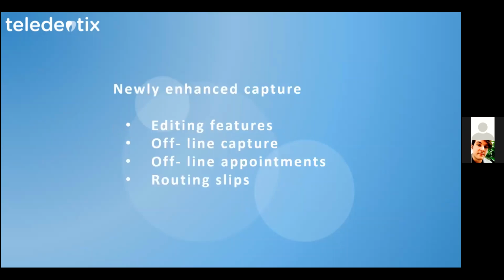All right, so just some really quick items to go over, just kind of high level. We have new editing features, obviously the offline capture. We also have offline appointment guides. So this means that you're not just tied into whatever appointments you already have on your calendar. If you have a patient pop up, I mean, that's production, right? That you would be losing out on if you didn't have any connection.